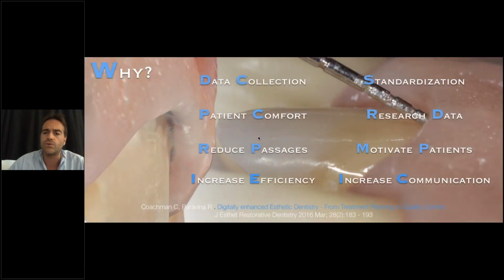And first of all, let's try to answer why should we focus on digital dentistry, and why should we implement our daily routine with the digital armamentarium. But first of all, think about data collection. Think about having a digital data collection, a digital prescription, the patient comfort, the opportunity of reduced passages.